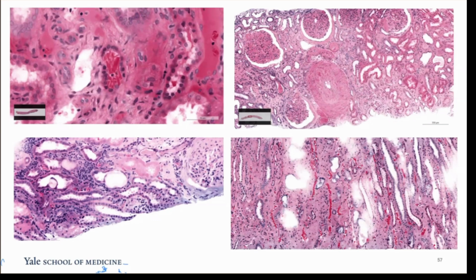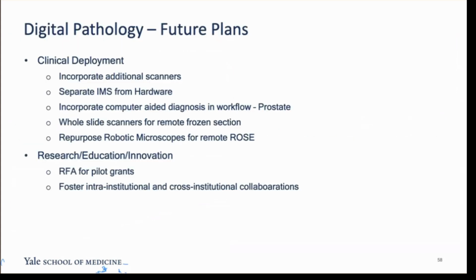So in our study, what we found is that we get comparable histology which is non-destructive and goes deeper into the tissue. And one advantage of this technology is that not only can we give a preliminary diagnosis with non-destructive microscopy, we can then embed the tissue, put it through routine paraffin processing, and not lose any downstream ancillary tests. So we can do immunohistochemistry, and we can cut H&E slides after multiphoton microscopy.